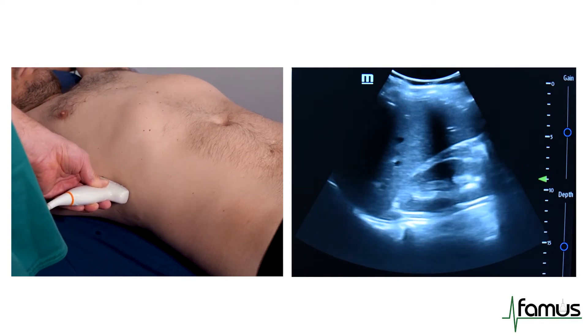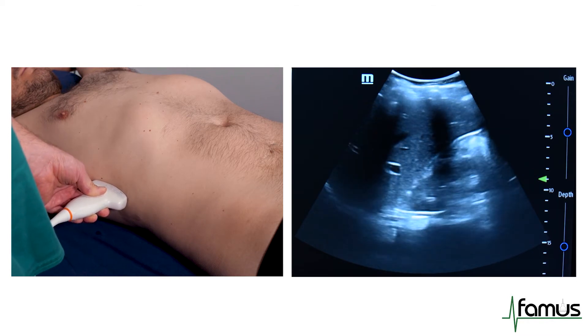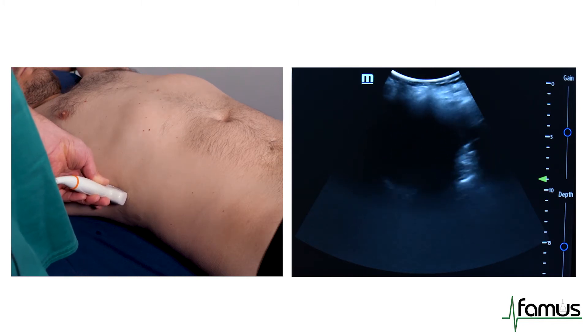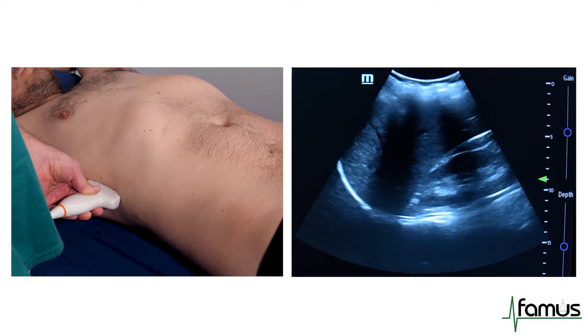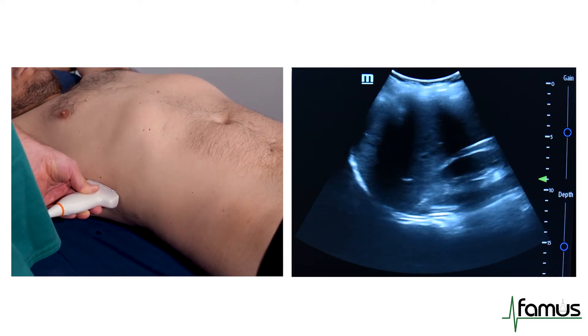I will then tilt my probe slightly anteriorly to the kidney and slowly tilt through the whole organ until I am posterior to the kidney and can't see it anymore. What you can recognize here again is the mirror artifact and the spine sign.